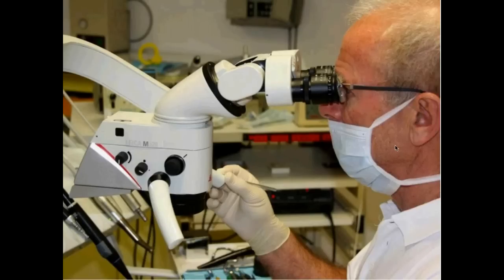The bigger problem is that your mirror, and when you work in the upper jaw you will always work with a mirror, will be contaminated and blurred. But as I told you, there was a picture of a rotating mirror I'm using quite a lot, and it centrifuges the water and the debris and dirt away.